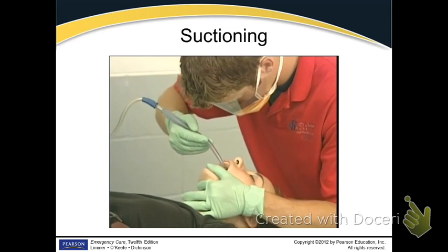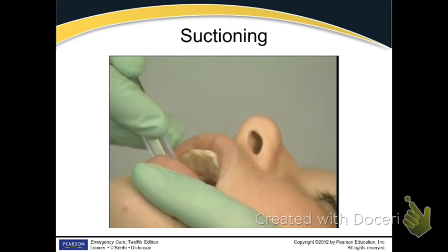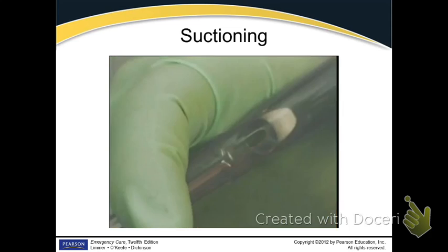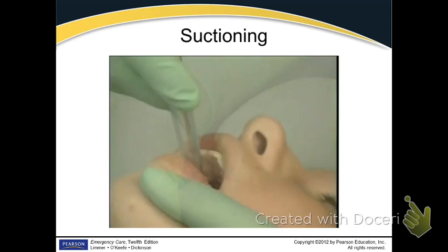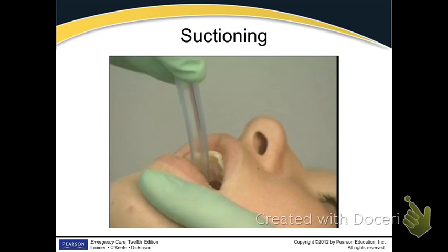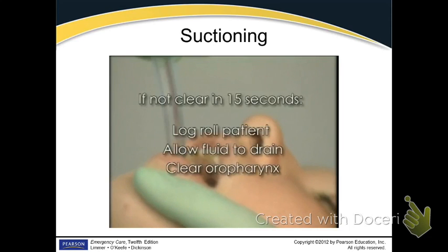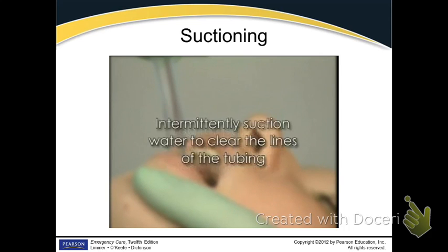Insert the catheter until the tips of your fingers reach the patient's lips. Apply suction by turning the unit on or occluding the hole in the catheter, and suction for only up to 15 seconds at a time to prevent the patient from oxygen deprivation. If you cannot clear the patient's mouth in 15 seconds, log roll the patient onto his or her side immediately to allow the fluid to drain from the mouth and clear the oropharynx. Intermittently suction water to clear the lines of the tubing.